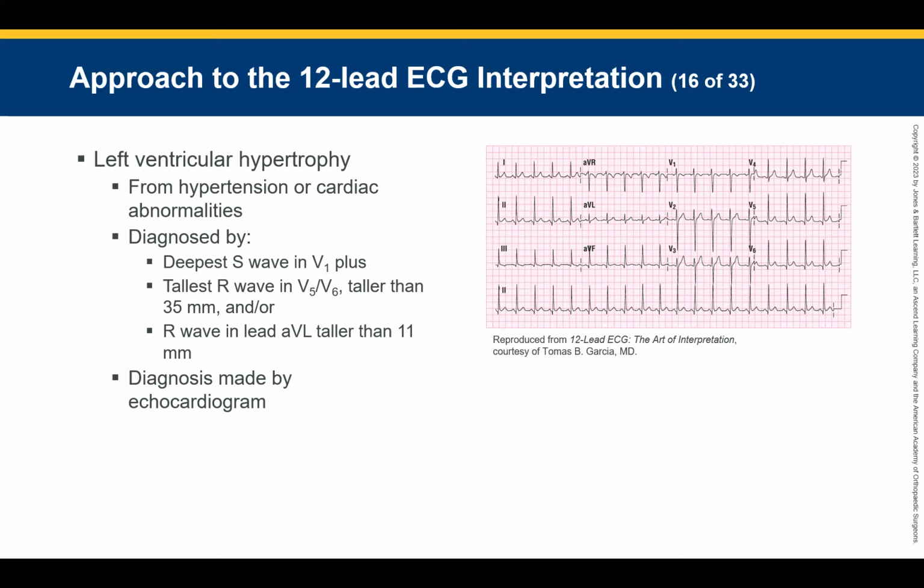You can have what's called an anterior septal, which bleeds over, hitting both the anterior wall and the septal wall, the front and the center of the left ventricle. So everywhere besides V2 and V3 you need 1 box of contiguous leads. Correct.